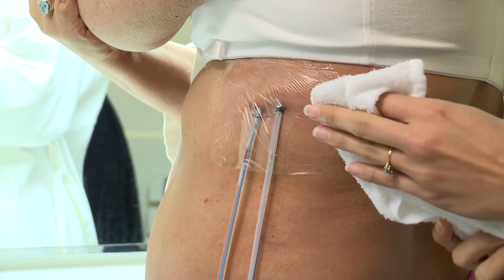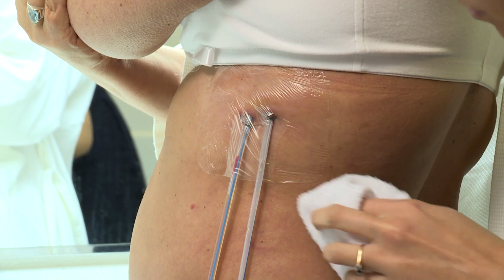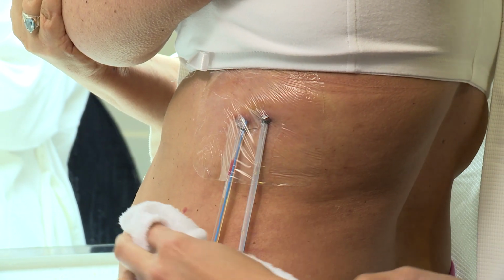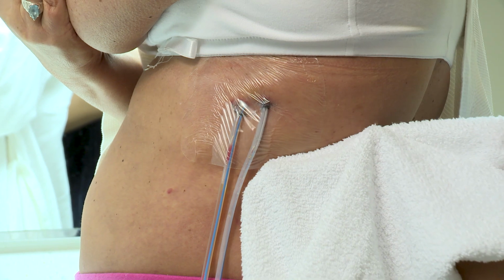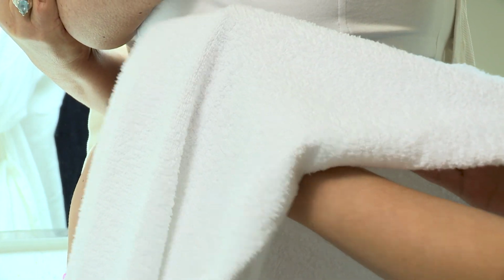Remember, if you are unable to shower, clean the area at least one time each day. Without removing the Tegaderm, gently wash the area with soap and water and rinse well. The same Tegaderm dressing stays in place over your drain insertion site until you return to see your surgeon for a follow-up.